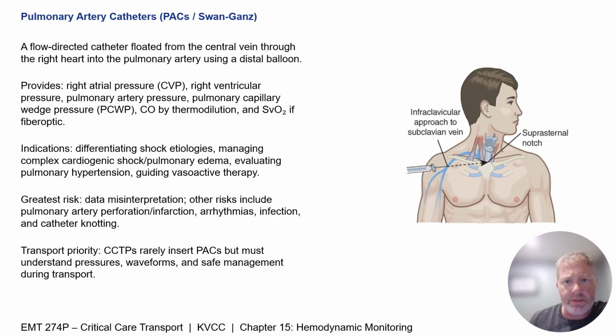These values can help to distinguish types of shock and guide you with your management, especially in complex cases. The catheter, though, is only as useful as your interpretation of the data that it provides.